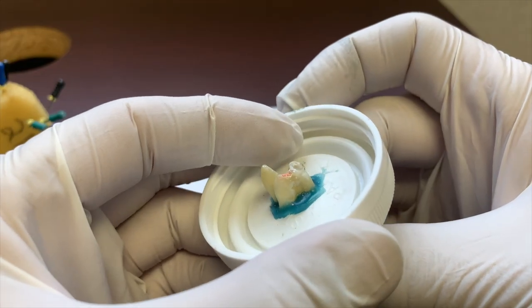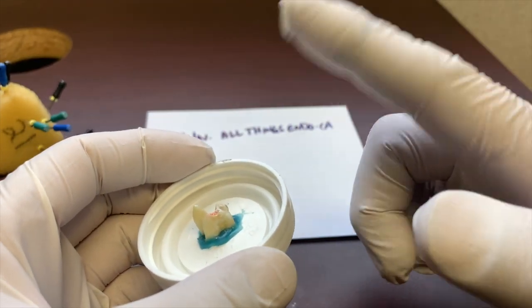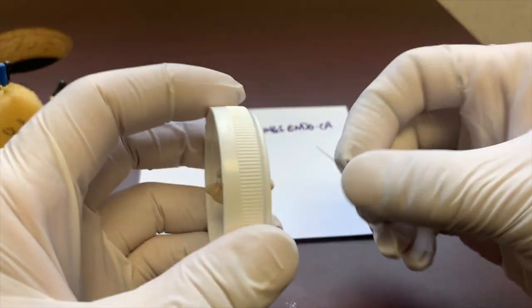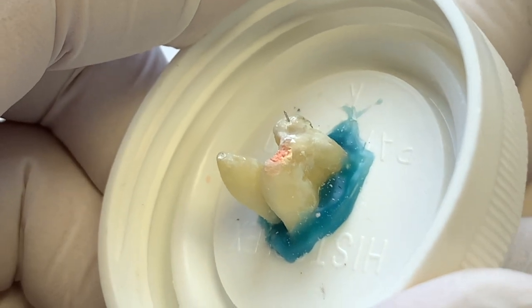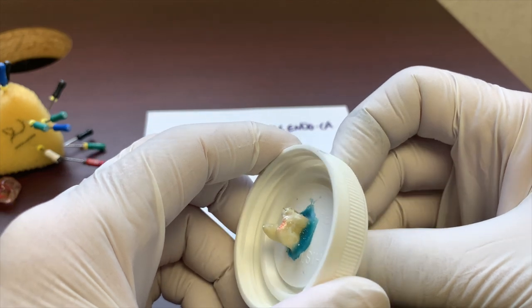If you're using a 10 file and trying to get your working length and the meter's going like that, and you're almost pulling your hair out, increase your file size to a point where you get a solid reading. You may have to dry your canal a bit, but definitely, look how loosey-goosey that is. So that will help you by increasing your file size. You may have to go up to a 35, 40 to get a proper reading.